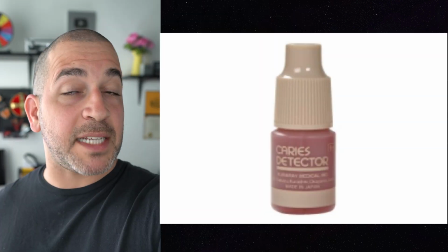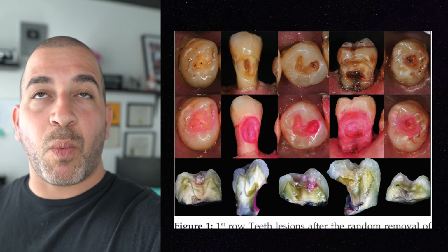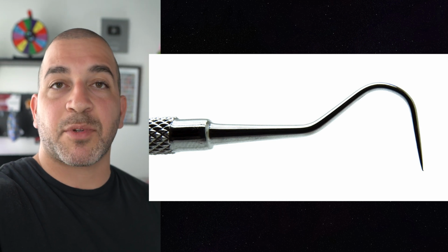Dentists have a variety of tools to allow them to distinguish when is the appropriate stopping point for caries removal. Some dentists will use something called caries indicator dye. It's a dye that you put on the tooth, and it essentially leaves a stain on the tooth where the cavity is. Another way to identify a stopping point is through tactile exploration with an explorer. If you're getting any sticky or peeling tooth structure, that is a sign that a cavity still remains.